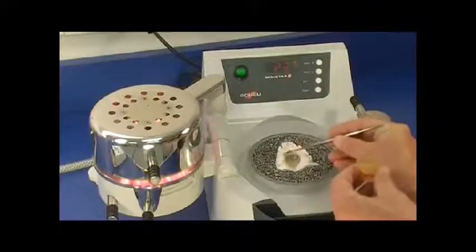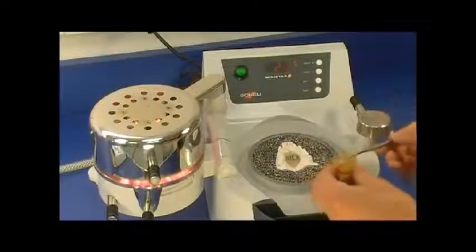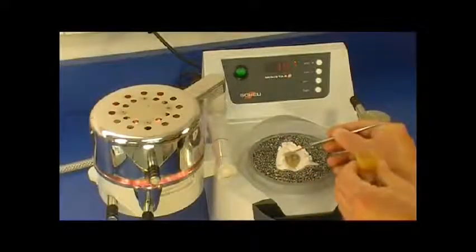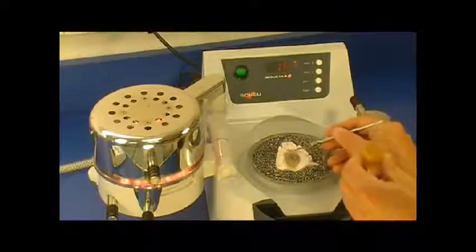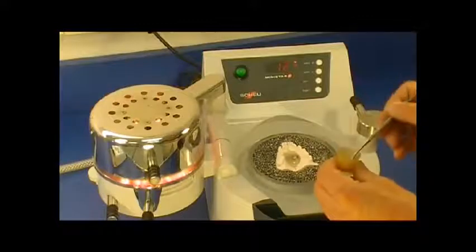With about 20 to 30 seconds remaining in the heating cycle, apply resin mix over screw and harden acrylic. Heating cycle and applied resin process should end simultaneously.